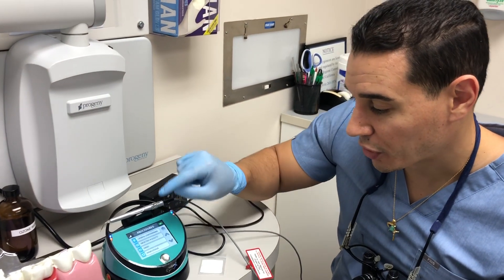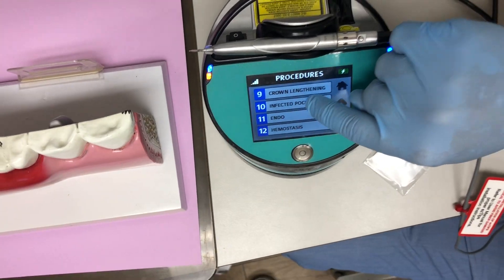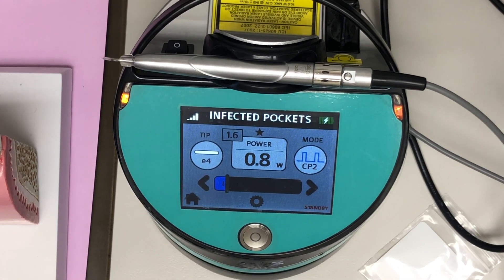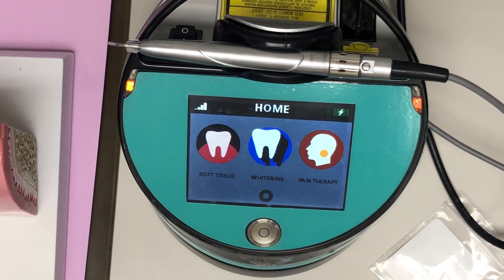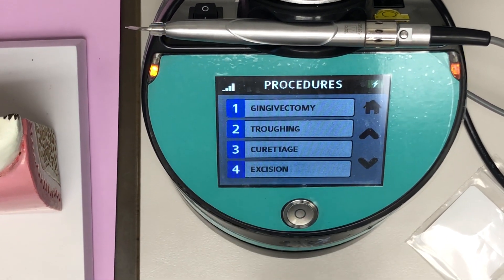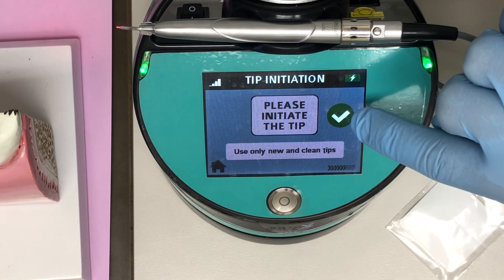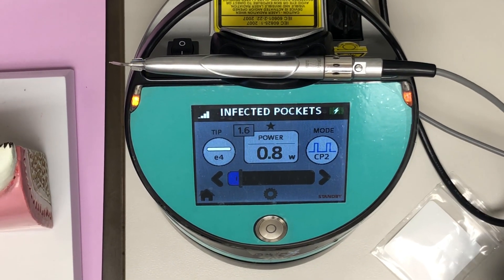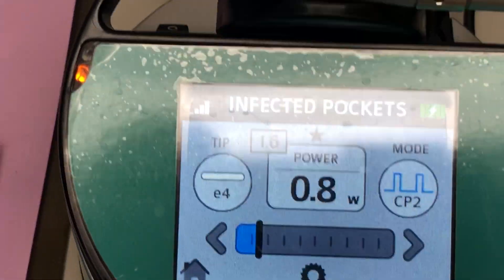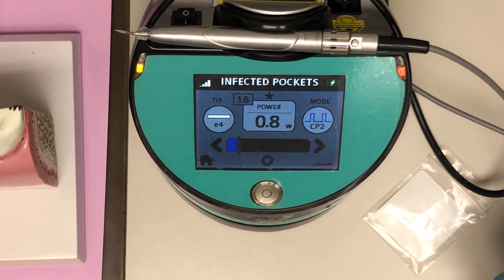We're going to be using the infected pockets setting — it's the 10th setting. Once you scroll up to there, press it, then press the check mark and you're ready to go. If for any reason you want to go back, you can always hit the home button in the bottom left corner to return to the main screen. Click soft tissue again, scroll through the menu until you find infected pockets, click it, then green check mark — those are the settings we want. In this case, we never initiate the tip; we don't need to, unless we're doing other more invasive procedures.